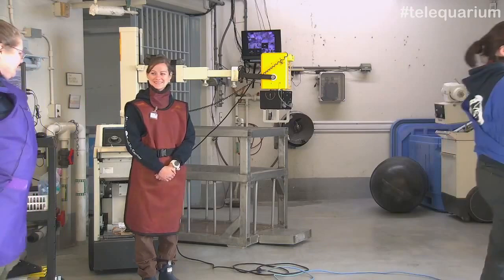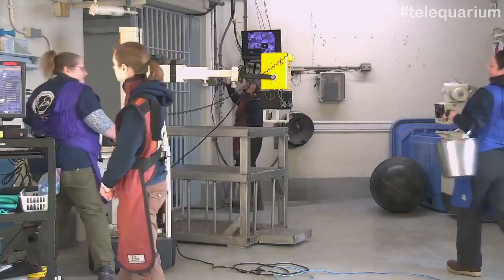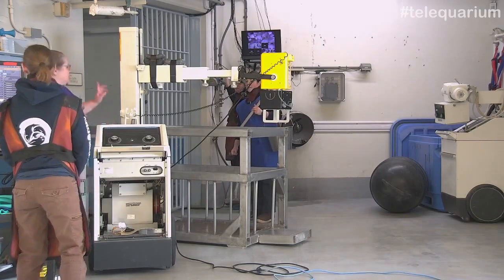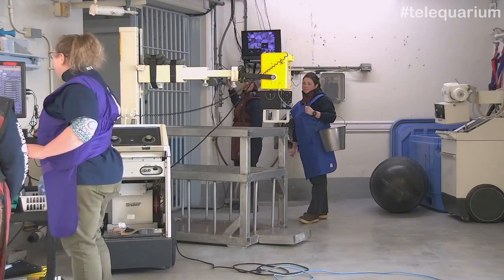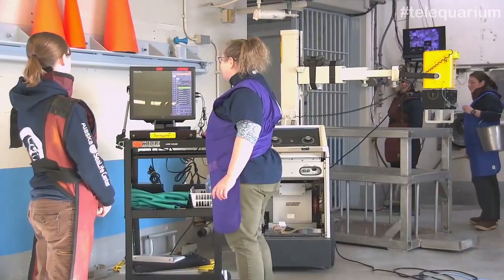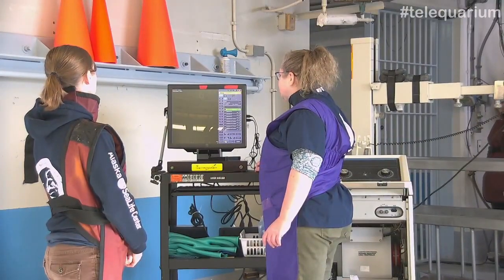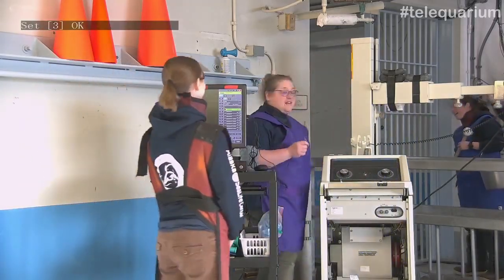Yep. Okay. Maybe she heard me. Maybe. Okay, so what we need, can you wait just one second? Our x-ray machine is all digital, and what happened is it went to sleep, so I'm just going to reactivate it. All right, we're good. Let's give this a go. Go ahead, thank you for noticing that.